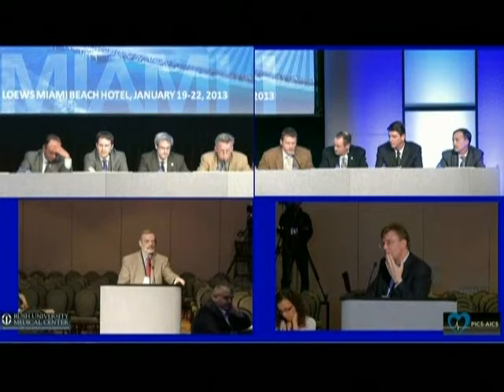Why aren't we getting dynamic images? Yeah, I think, and other speakers on the panel may have more eloquent answers, but yes, to get dynamic images, we will need to gate. And to gate with the current technology, my understanding is we'll have to increase significantly the acquisition frames, which increases the dose beyond the point where we necessarily want to go at this point. And as Dr. Carroll said, it's actually paradoxical that you lose image quality to some degree.